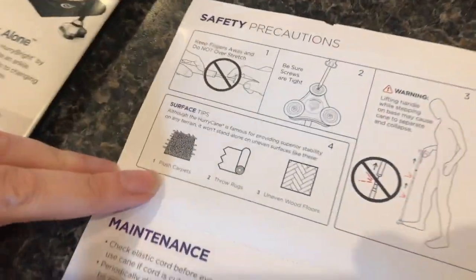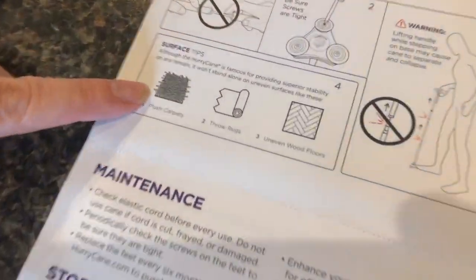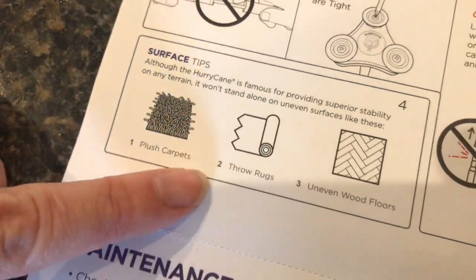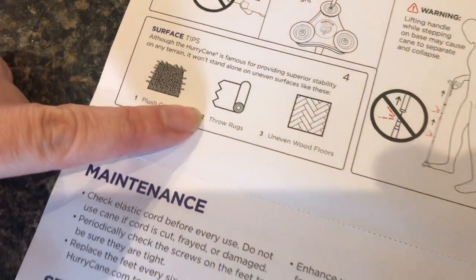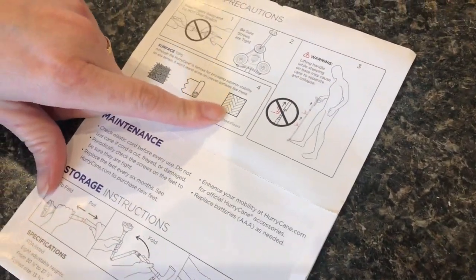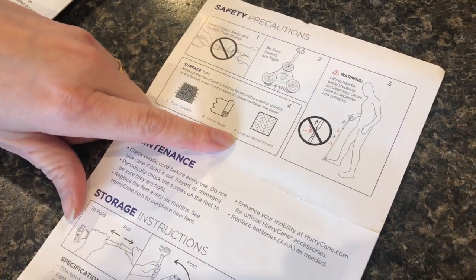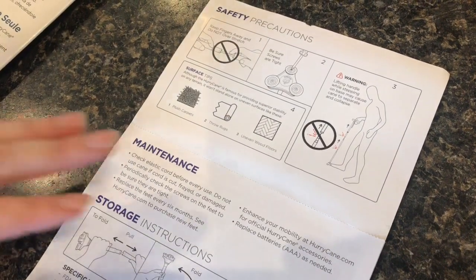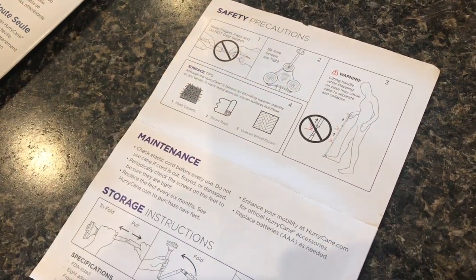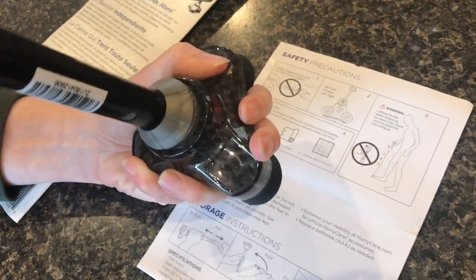Now, with these feet being so close together, this cane is not going to stand up well on very plush carpet, and it may or may not stand up on throw rugs — it does stand up on ours but ours aren't very plush. Of course if you have an uneven floor, whether wood or concrete, if it's really bumpy it's not going to stand up, but most floors will work.